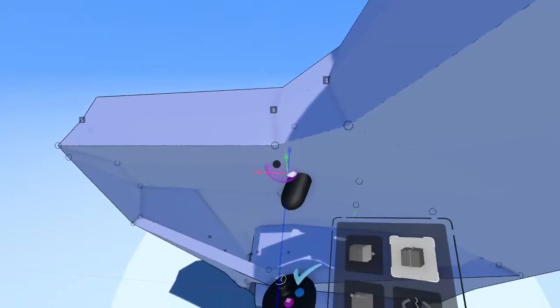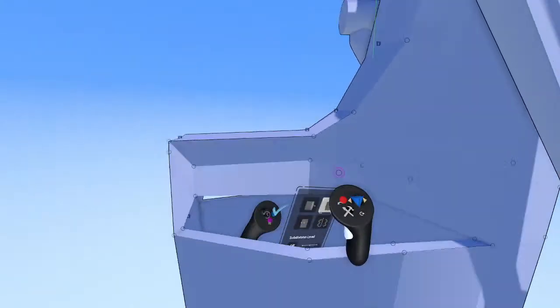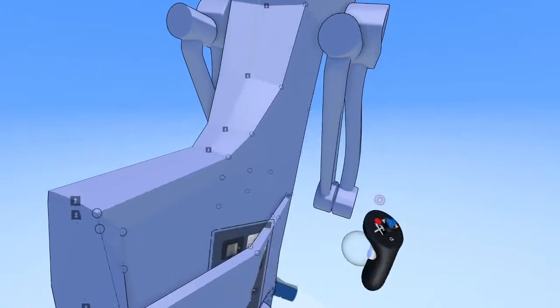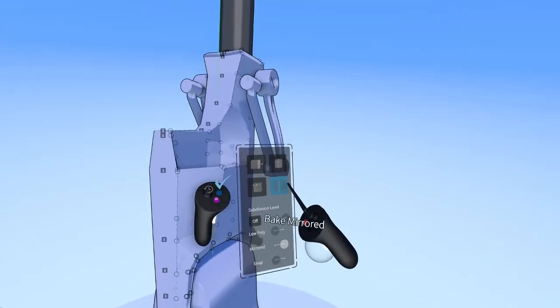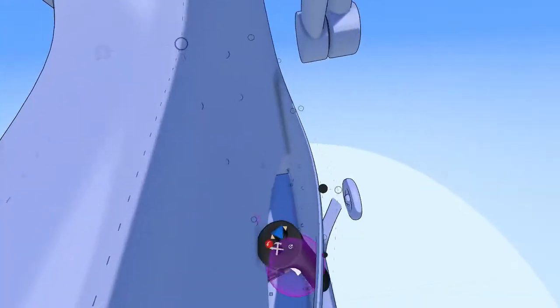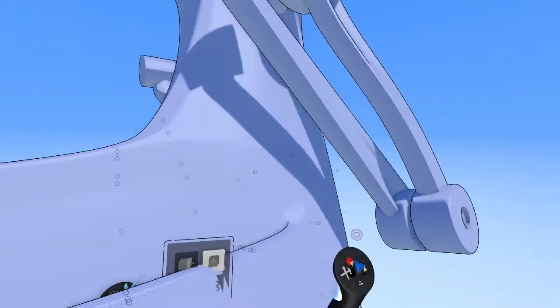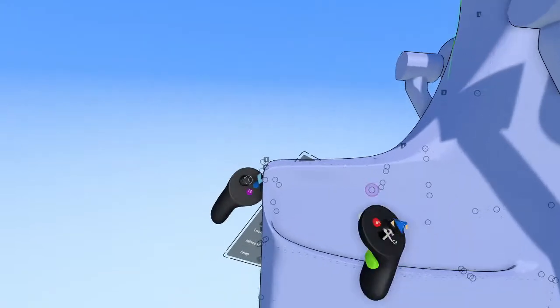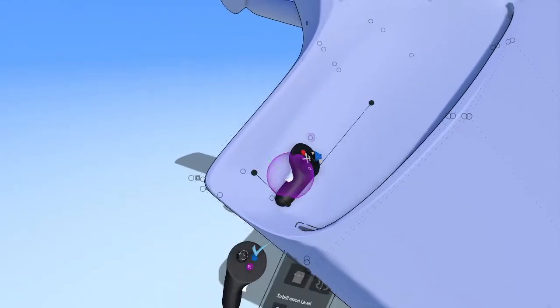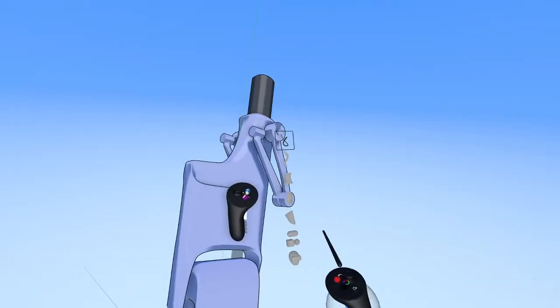And then let's turn subdivision off just so I can see in the low poly mode what these surfaces are doing. Select edge loops, drop that down like this, and that's going to be our shelf so far. We're going to mash some other shapes in there as well. Okay. And let's tighten the radiuses here.